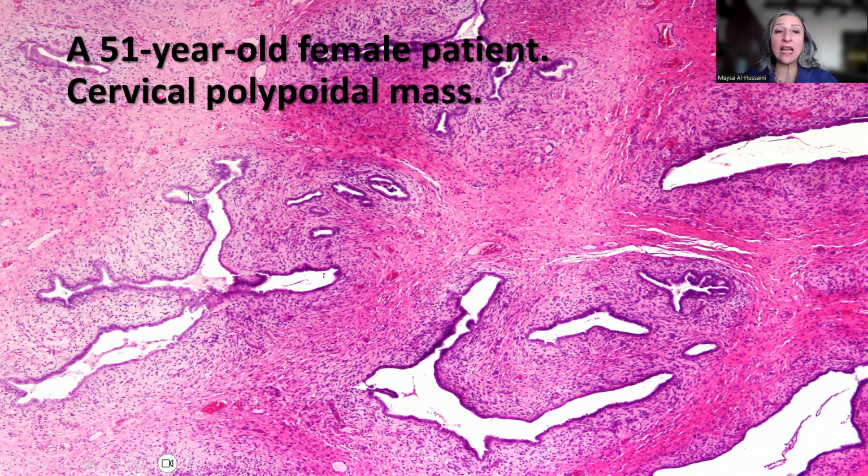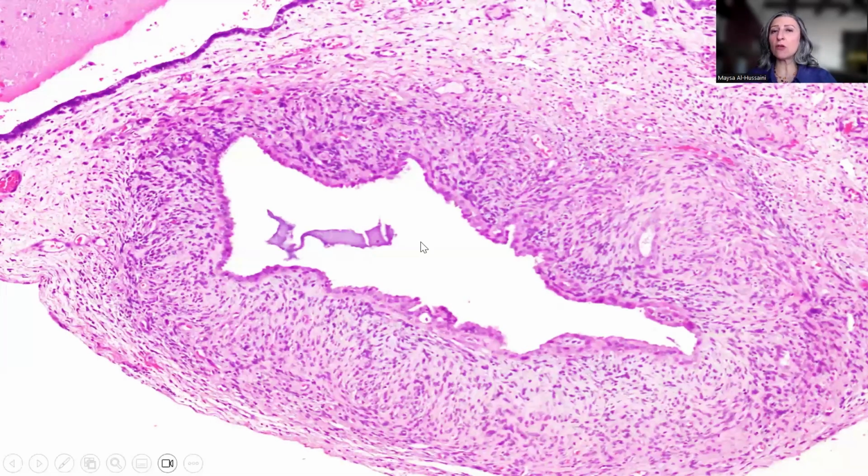So we have the glands sometimes with this serpentine growth pattern, and then we have condensation of the stroma around the gland with somehow predominance of the stroma over the glandular component. This is another focus, and again, this really reminds everybody that sees it on the low power magnification of phyllodes tumor of the breast.